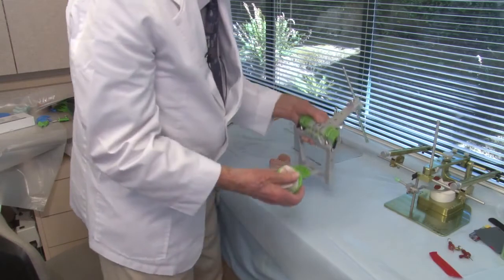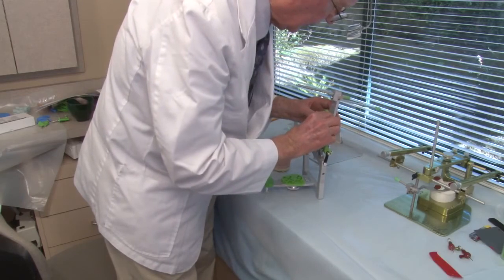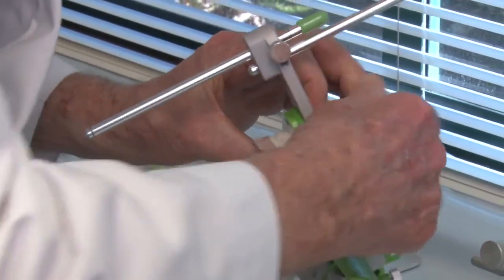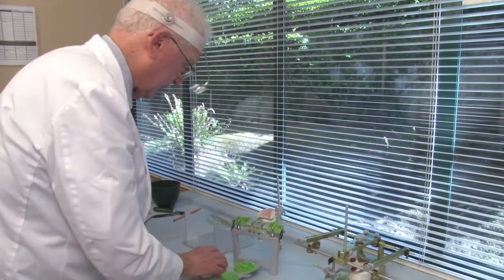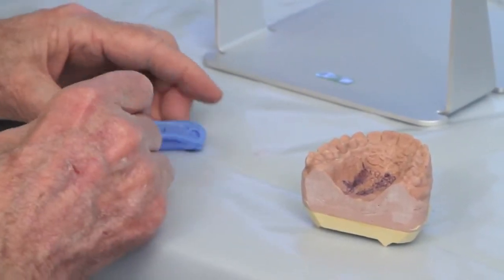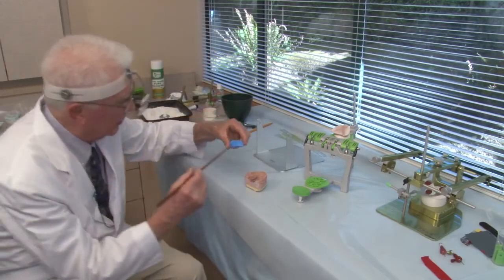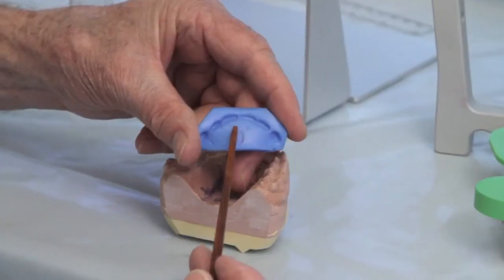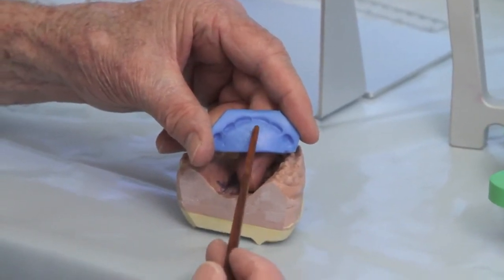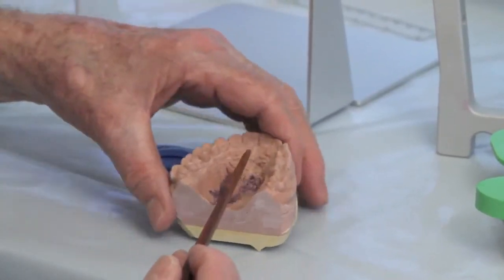Now I'm going to put the upper model on the articulator. Now I want to check my wax bite. If I look very carefully at my upper wax bite, or the bite of the upper teeth, you can see these little dots here. That's where it was touching soft tissue. Soft tissue, this would depress the soft tissue. In the mouth and the cast, though, that's hard tissue.